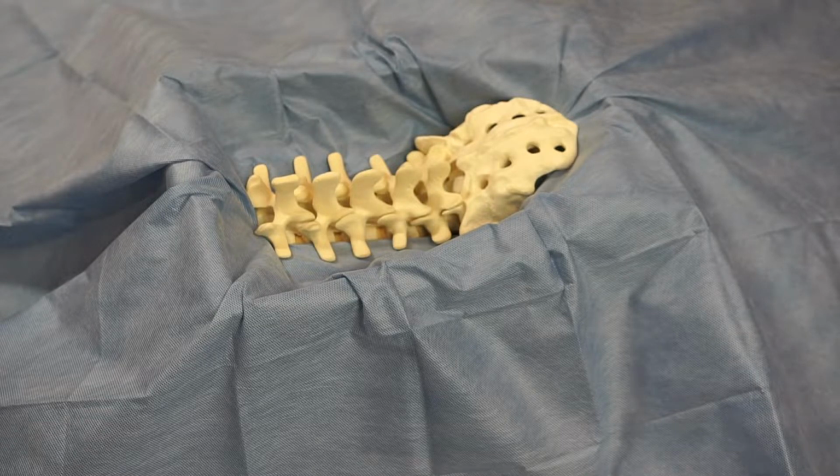Elevate the paraspinal muscles and other soft tissue to properly expose the spinous processes and lamina to the medial border of the facet joints. According to the surgeon's technique preference, the supraspinous ligament may be left intact, reflected, or removed completely. Ensure that the implant site is completely clear of connective or soft tissues, lightly decorticating the fusion area.